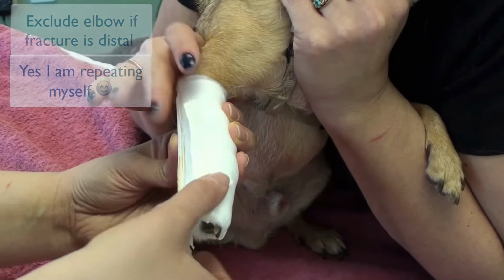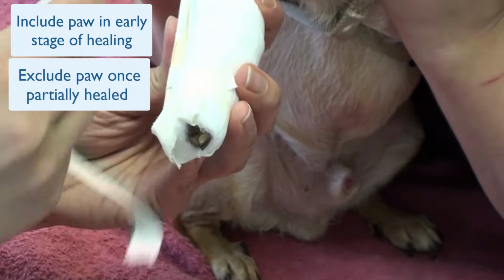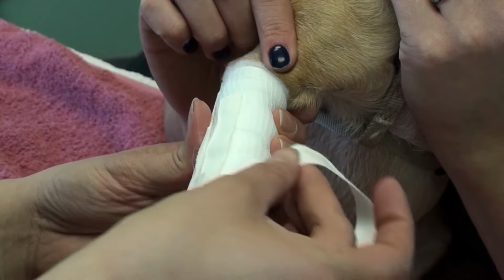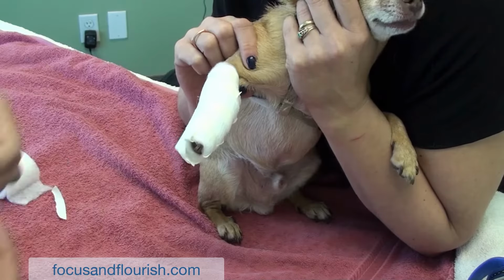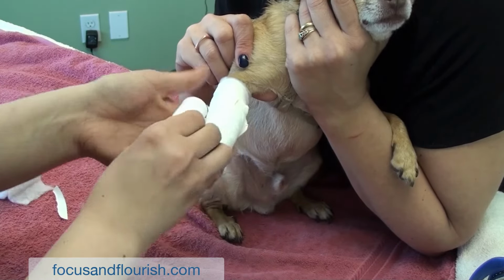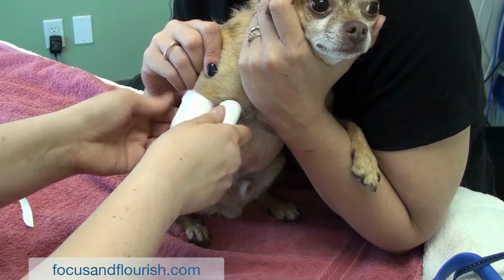I do that at the beginning of the fracture healing process, but once we're maybe 4 weeks in, depending on the age of the dog, I might make that splint a little bit smaller so they can actually walk on the paw. Jen is just taping the splint back in place with some white tape, and she likes to use the cling to help hold it in place. So notice how she has picked up the bottom of the splint in that first roll of the cling, and it's just there to hold the splint in place.